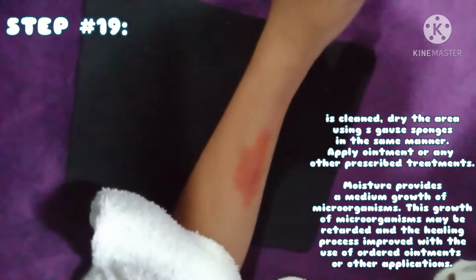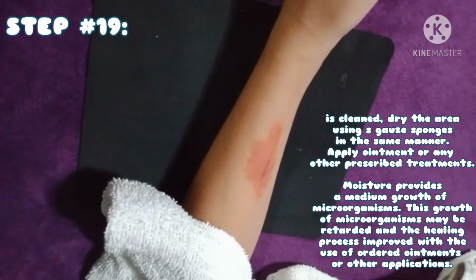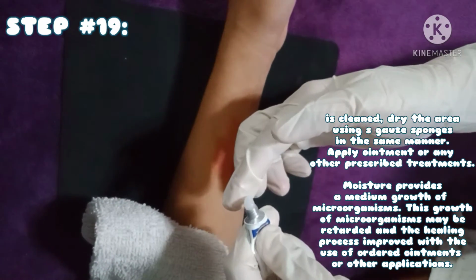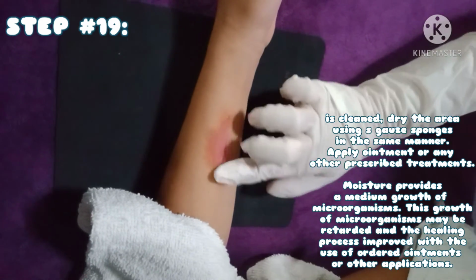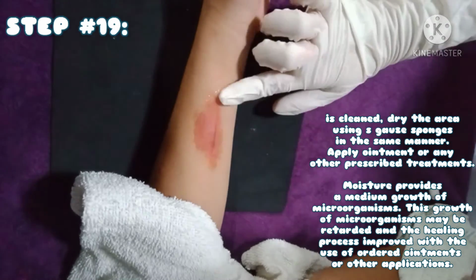Step number 19. Once the wound is cleaned, dry the area using a gauze sponge in the same manner. Apply ointment or any other treatments if ordered. Moisture provides a medium for growth of microorganisms. The growth of microorganisms may be retarded and the healing process improved with the use of ordered ointments or other applications.